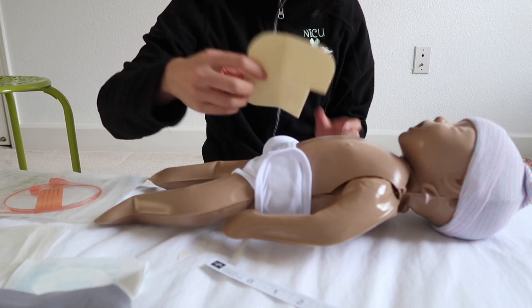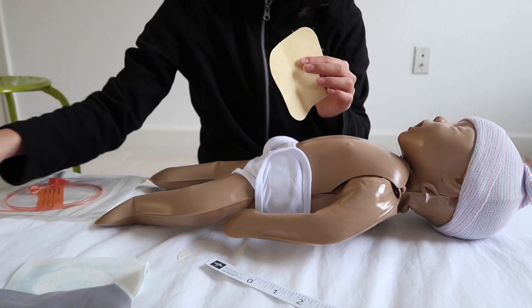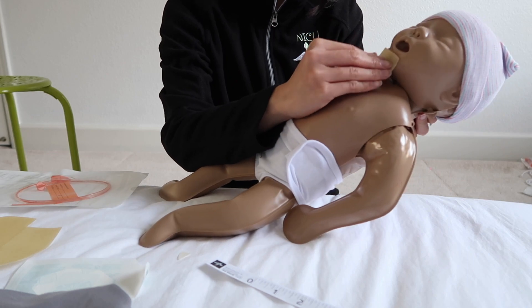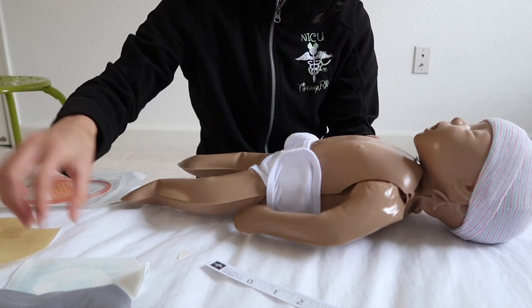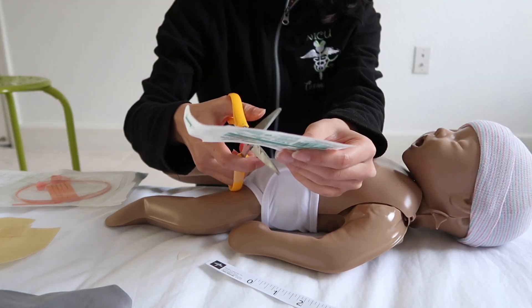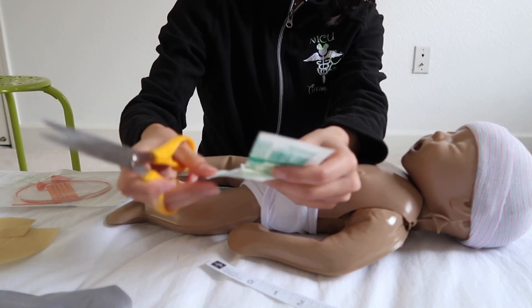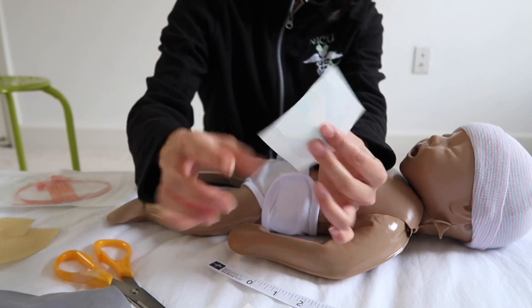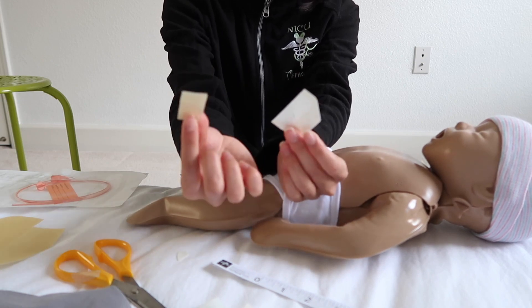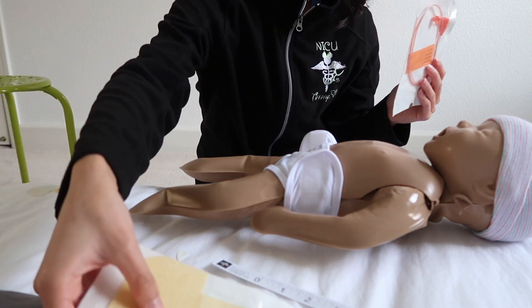You're also going to need Duoderm — it usually comes in a packet and is used to protect the baby's skin. I've already cut a small square piece; make sure it fits underneath your baby's chin. You'll also need a piece of Tegaderm, which we typically use for IVs. I like to cut it in half so you have two pieces — leave one in the drawer and use one now. Have your Duoderm and Tegaderm cut out and ready next to you.